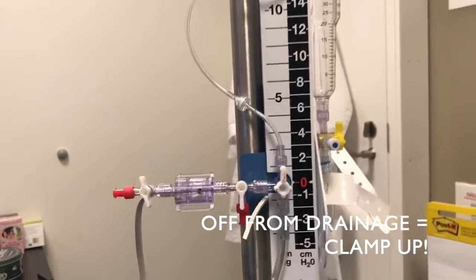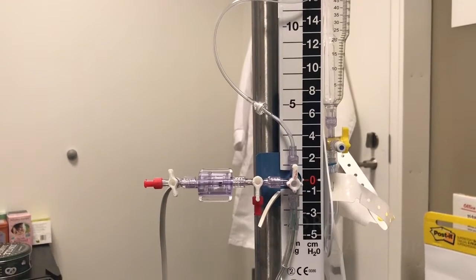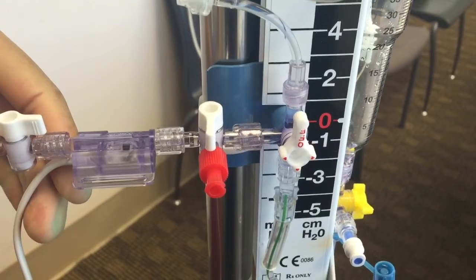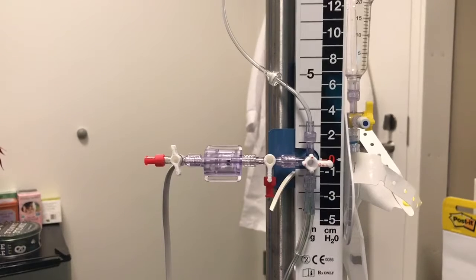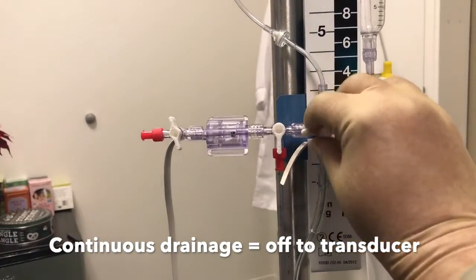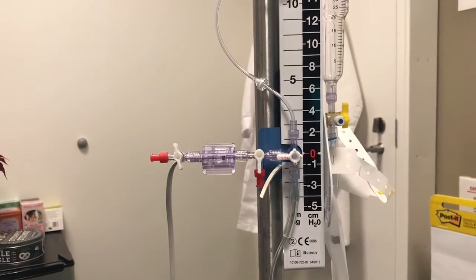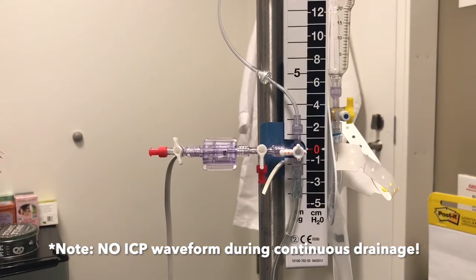To clamp the patient off from drainage, the stopcock is turned off to the EVD drip chamber. To help you remember: clamp up. When your patient is clamped off to drainage and open to the transducer, you will obtain an ICP waveform as shown. Please allow ICP to stabilize for 30 seconds to a minute for ICP accuracy. To resume drainage, position the stopcock so it is turned left towards the transducer. Note that you will not have an ICP waveform during continuous drainage.